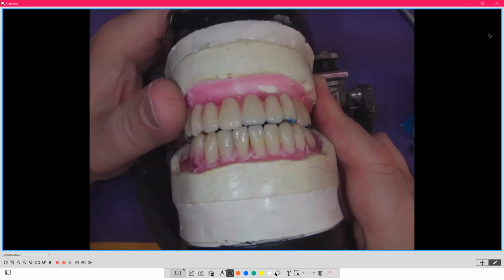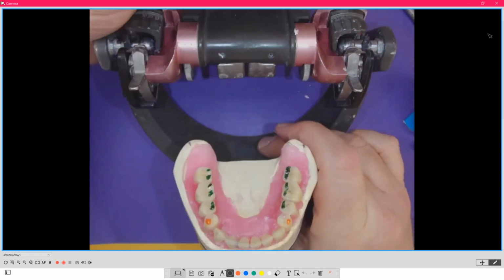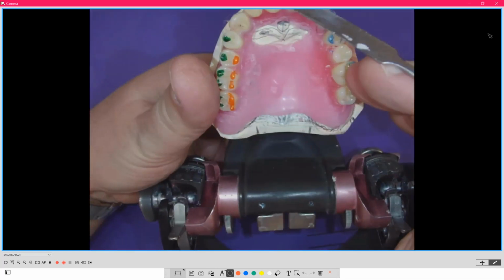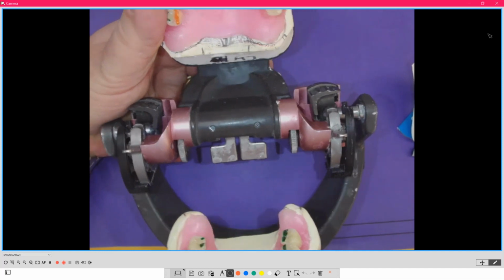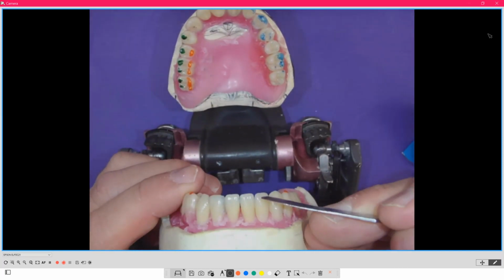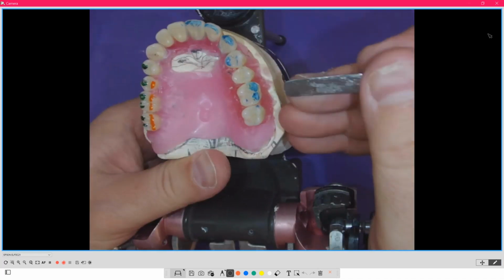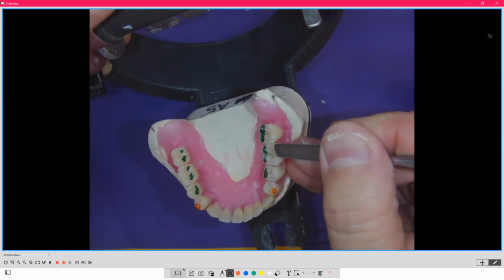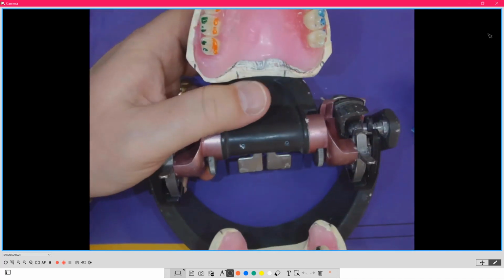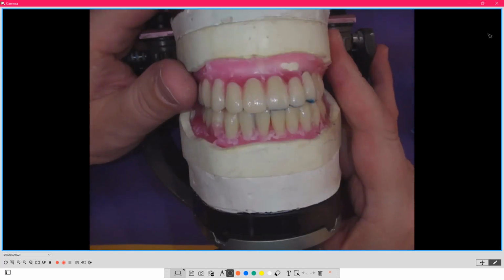And then I would go back in the mouth, and then I would have the patient say days of the week, months of the year, in English and in their mother language. And they're going to move and talk and function for me. And then I'm able to go and look. So for example, if there's an issue, this blue mark here is going to transpose itself onto the incisal edge down here, and then I'm able to look for it. It'll be slight, but it'll be there. Or for example, the buccal up here will transpose itself down here, and then I'm able to see it in the mouth. And then I'm able to adjust it, and I don't have to polish it afterwards because of the acrylic glass.